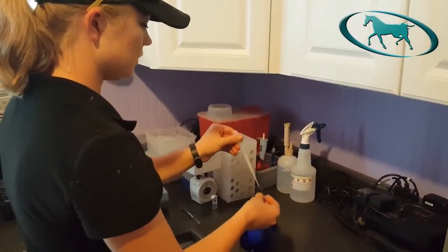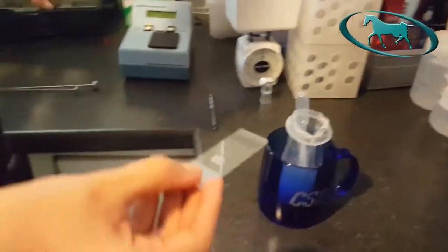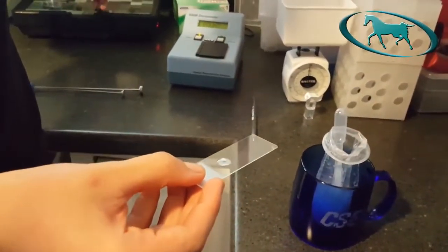I will put some of the semen on a slide — just a drop — so that I can look at the motility and morphology of the sperm.